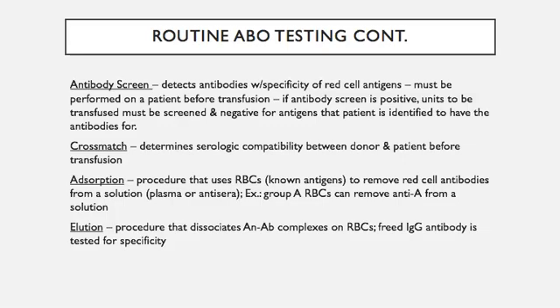Okay, the cross match determines the serologic compatibility between the donor and the patient before transfusion. So in the cross match, we've decided, or the doctor has decided, the patient needs transfused blood. We have to cross match the donor unit of red cells with the patient's serum or plasma to make sure that they are compatible.